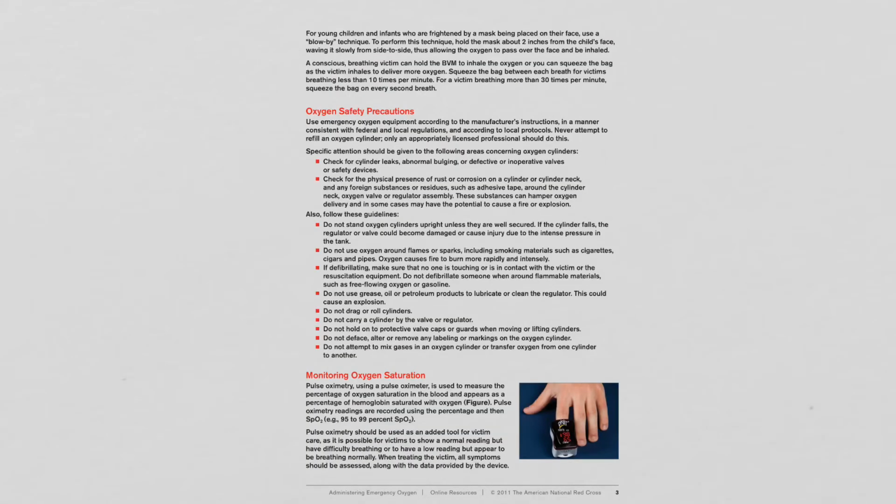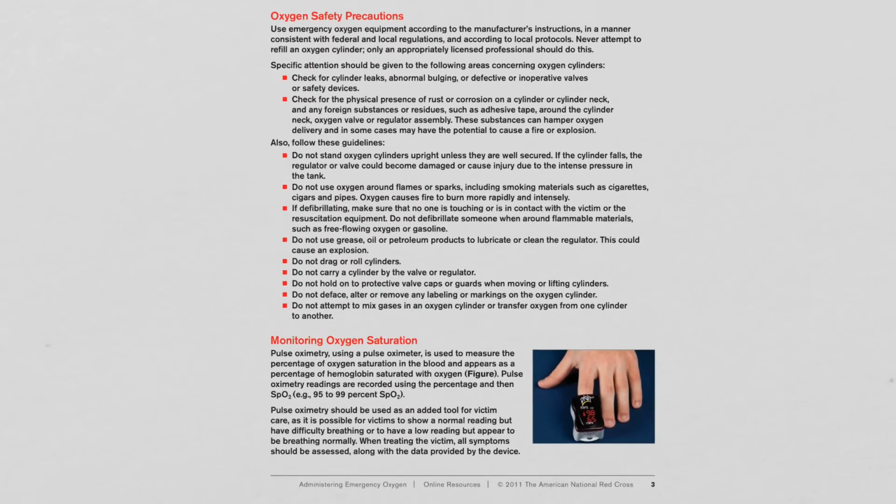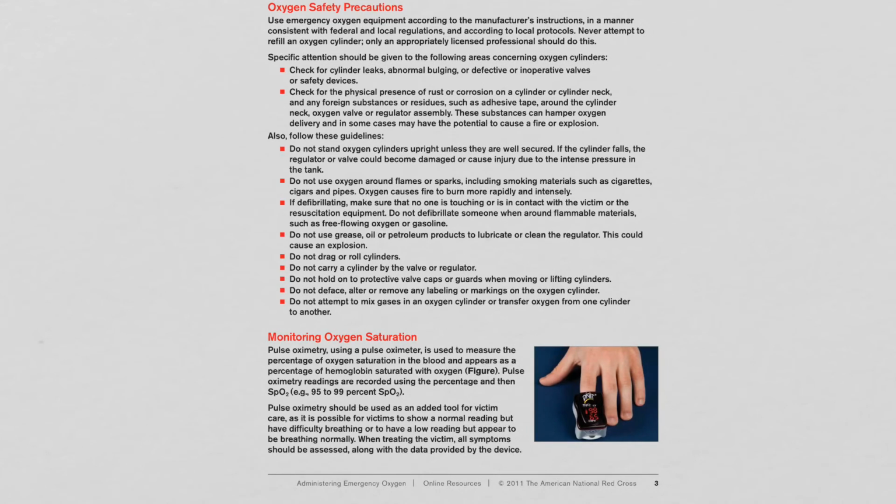So prior to delivering or administering oxygen, there are some safety precautions that we probably should follow. Some of those safety precautions are listed here. I'm going to give you probably the top 3 that you should be concerned with.